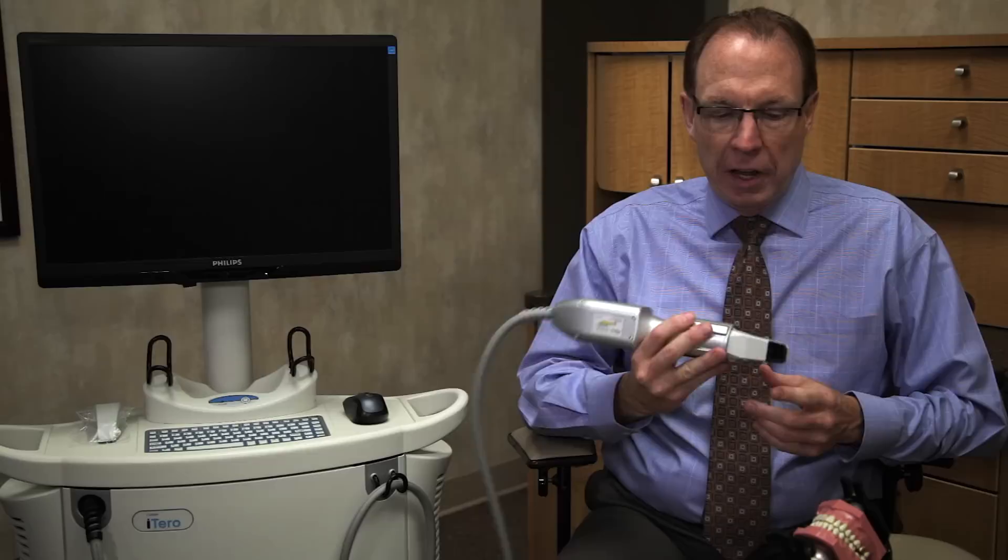This little scanner right here shoots out laser light. It reflects off of the teeth, comes back into here, and goes into the computer and creates a three-dimensional image on the screen, much like a CAD-CAM image that you've seen in other areas of technology.